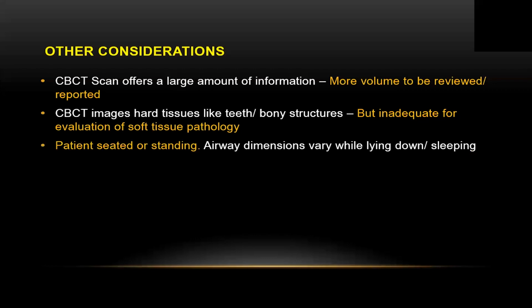but again, specific situations will differ. And another disadvantage or a shortcoming or limitation of cone beam is patient is awake and they are seated or they are standing, depending on the unit that you have in your office. So the airway dimensions might vary when the patient is laying down or sleeping.